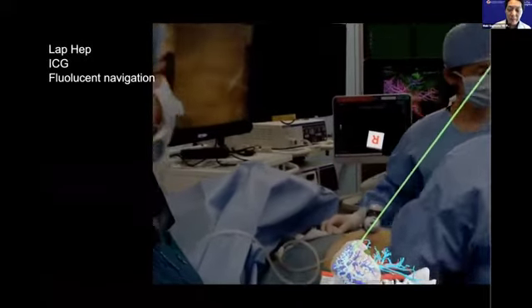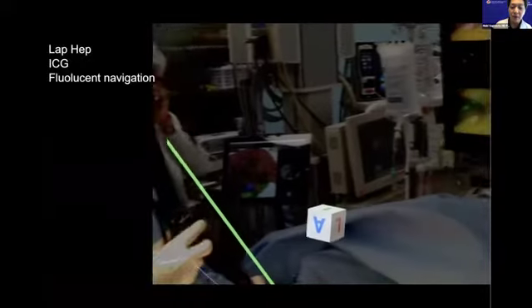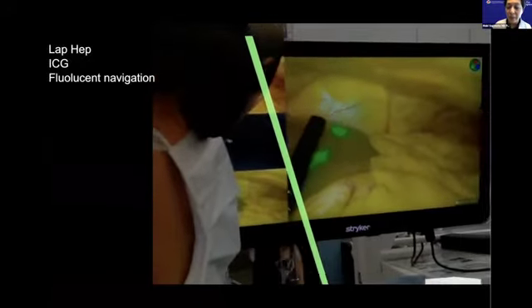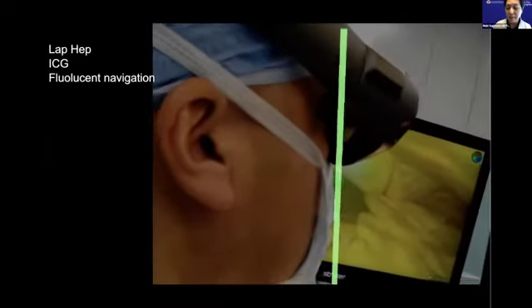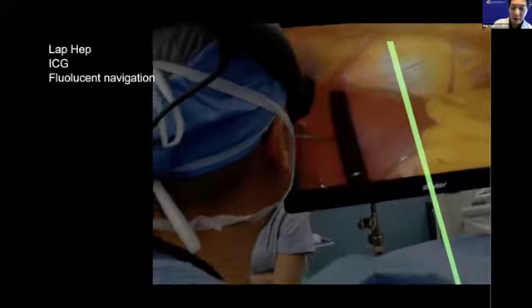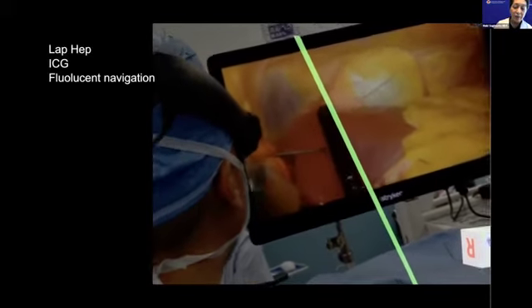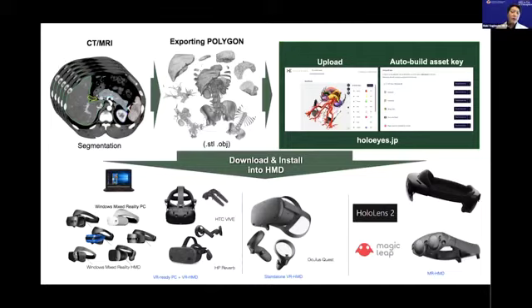This patient had a liver cancer, and we should put the needle into a portal vein to stain with ICG using the fluorescent navigation, but it is very difficult to put the needle into a portal vein because this surgery is a laparoscopic hepatectomy. You can see the tip of the ultrasonic probe in the abdomen, and you can see the guideline through the abdominal wall to the tip of the endoscopic ultrasound. So all you have to do is put the needle along the green guideline like this. So we completely put the needle into the portal vein. The fluorescent navigation could be done. So this is how to do it.